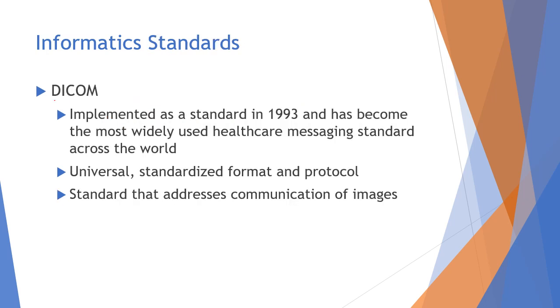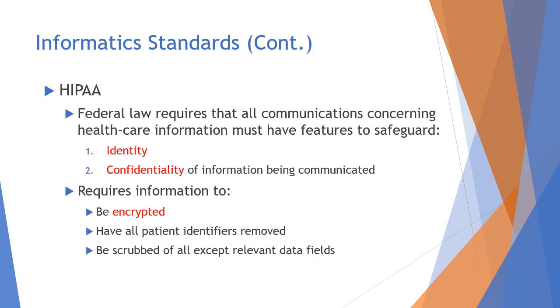DICOM was implemented as a standard in 1993 and has become the most widely used healthcare imaging standard across the world. It's a universal standardized format and protocol that addresses the standard for communication of images. HIPAA is a federal law that requires that all communications concerning healthcare information have features to safeguard identity and confidentiality of information being communicated. It requires the information to be encrypted, have all patient identifiers removed, and be scrubbed of all except for relevant data fields.